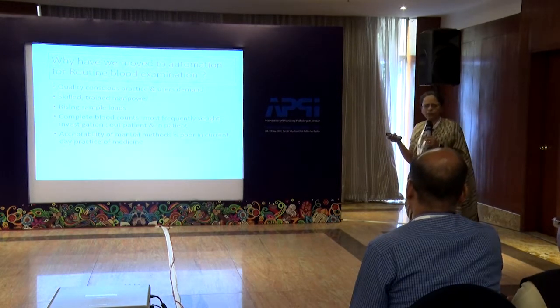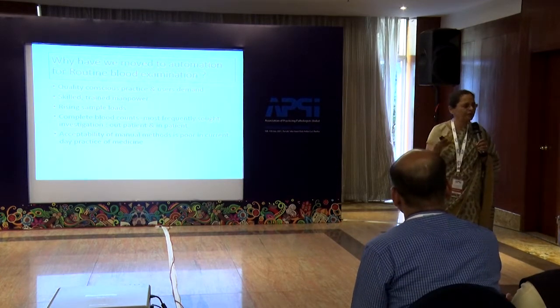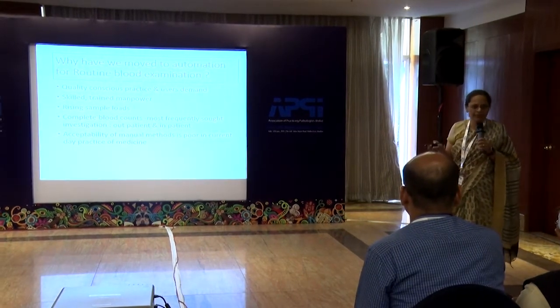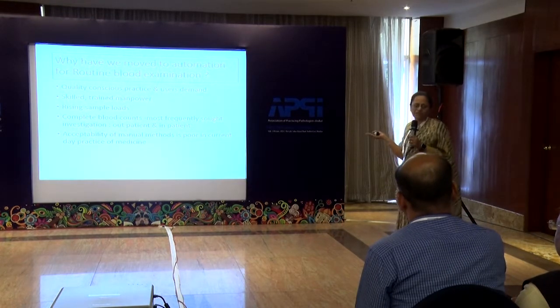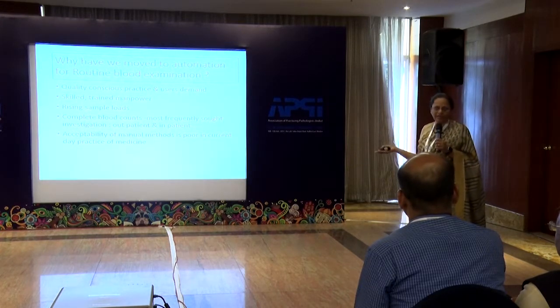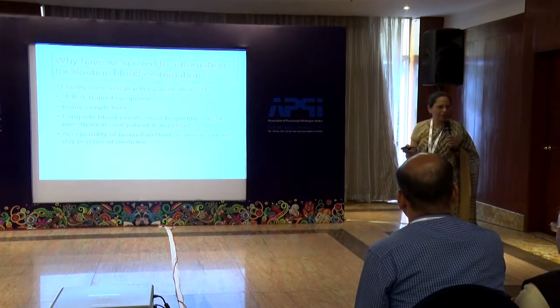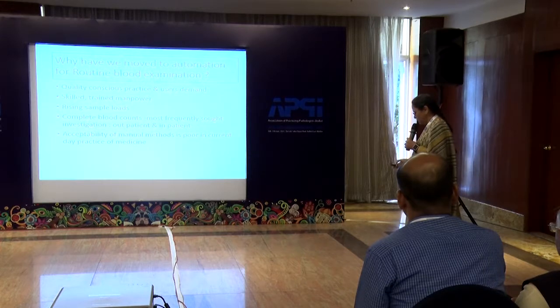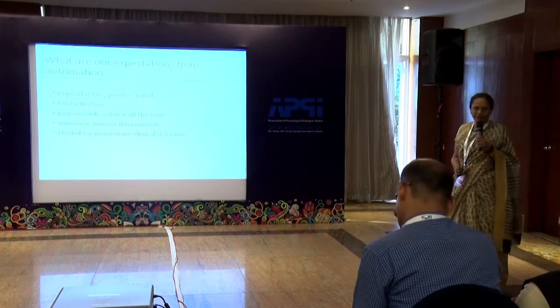There is also a rising sample load. Earlier, there used to be hospital-based testing, but now individual laboratories are testing for patients on whom we do not even know why we are doing the test. So the sample load has enormously increased. And this is the most common investigation asked for, whether you're serving an outpatient population or a hospital-based laboratory. So that's the reason why we had to move to automation from conventional methods.